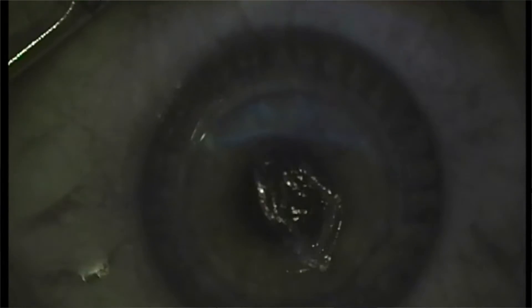The Visimax laser is equipped with two slit lamps that allow you to check the interface. Also, it is advisable to put the lenticule on the cornea and fold it out to check that it is nicely round and complete.